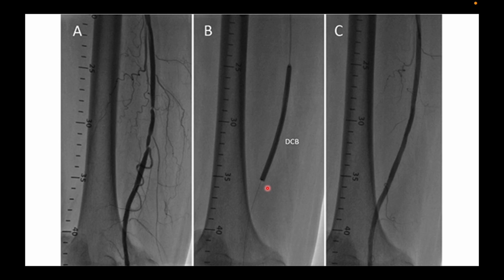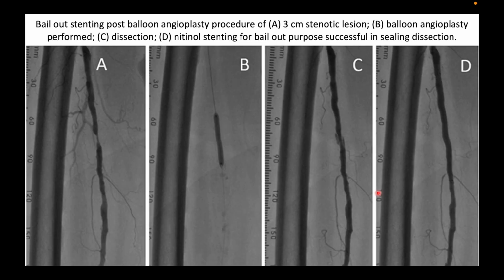Otherwise, below the knee, you prefer not to use a stent, but in the iliacs, the subclavians, the external iliacs, common iliac, these are the areas where you prefer to do a stent rather than leaving with a balloon alone. So very nice result with the drug coated balloon.